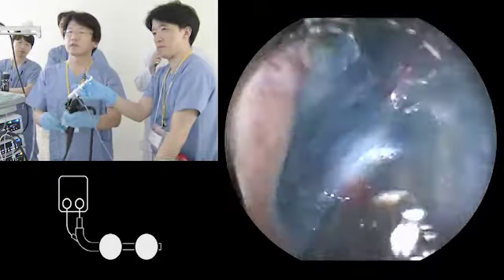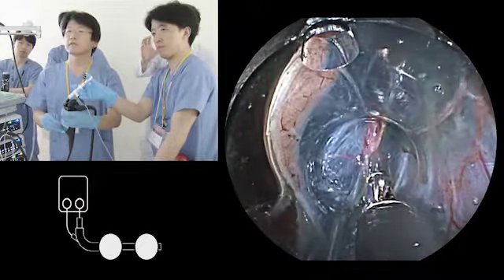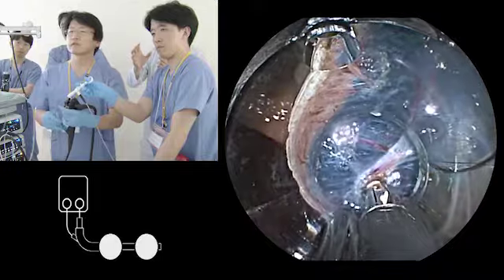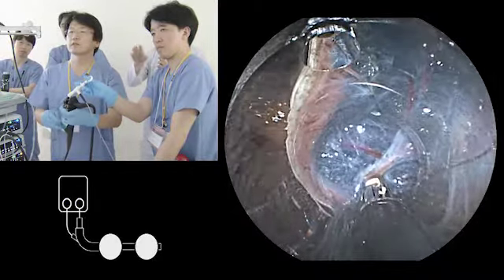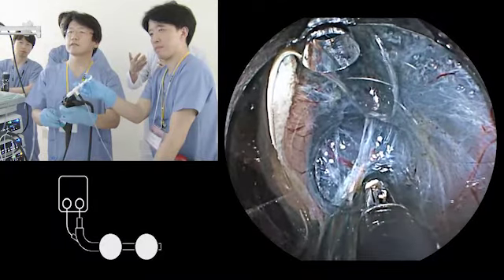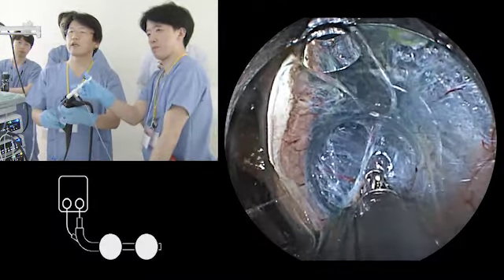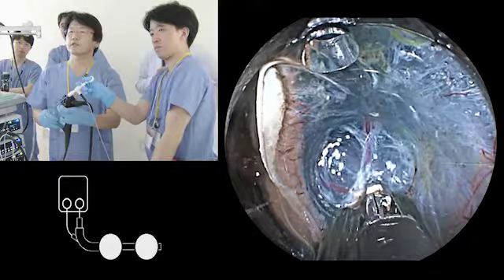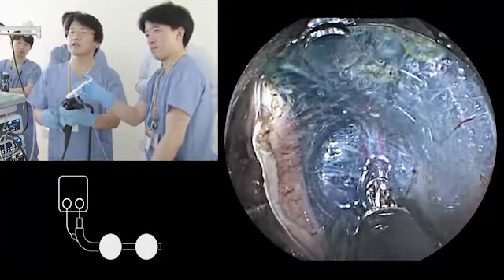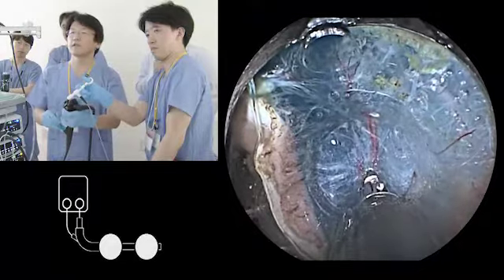But Professor Yamamoto, if you use the conventional ST hood and the Flush Knife BT, it's a little bit difficult to see the tip of the Flush Knife directly. You're right. But after you get used to using it, you can guess the tip of the knife.